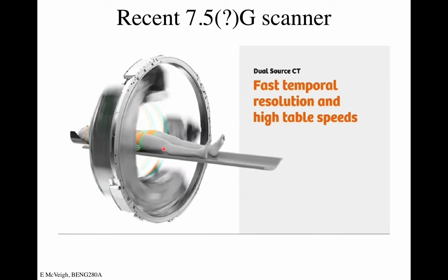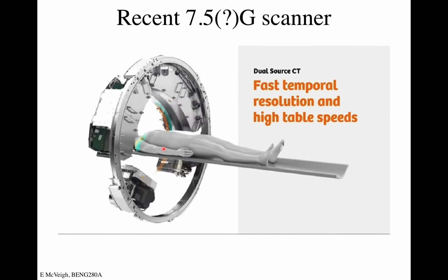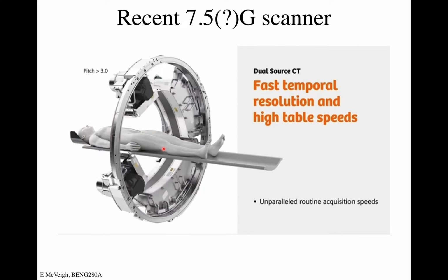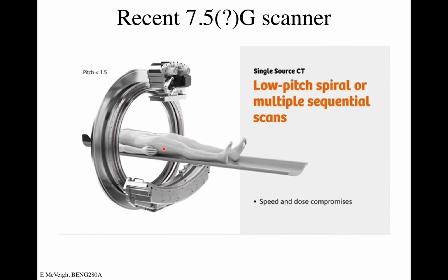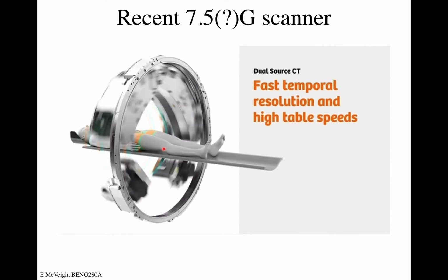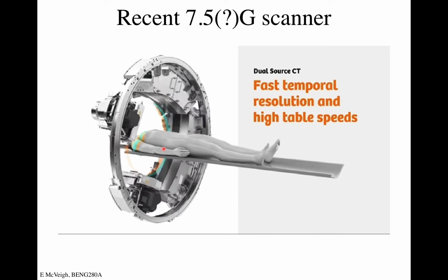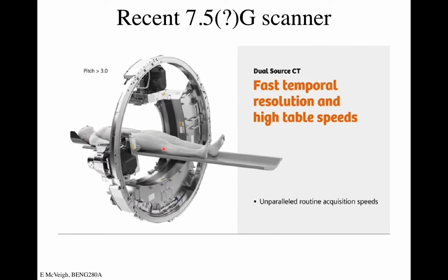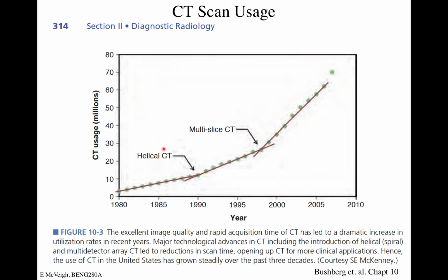I've been scanned in it, and you sort of fly through it. And I really don't know about the acceleration. Like you'd think that when you're zooming through there, your organs would be sort of affected because they're being accelerated, right? They claim, no, we have the ramp up, acceleration and velocity such that we hit our steady velocity when we're imaging, but I don't know about that. I would love to put a bowl of water on one of these tables, just to image it going through and see if it was tilted up to one side. Anyway, this turbo flash mode is pretty impressive.